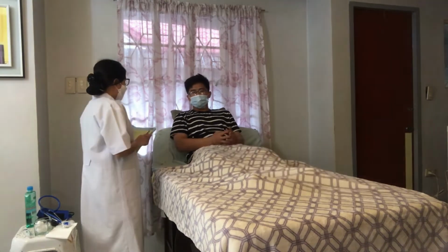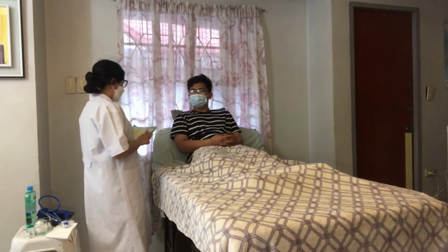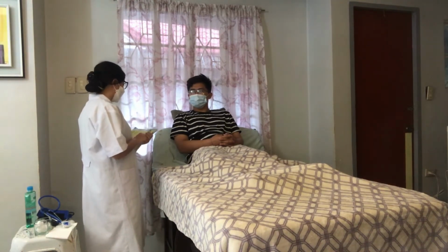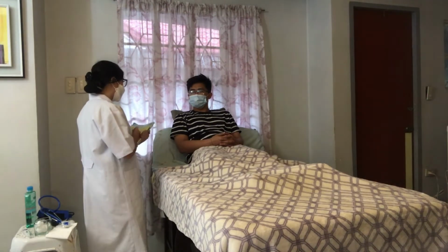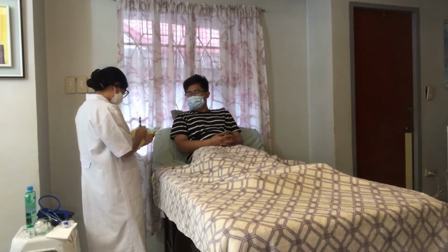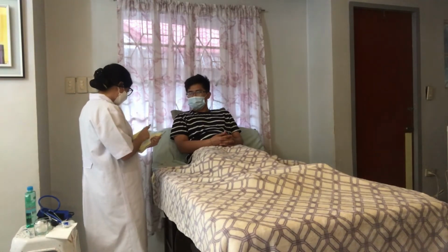Good day, sir. I am Erica Acido, and I will be your student nurse for today. So I will be taking your vital signs as per instruction by your doctor. So before that, sir, may I know what is your name? Right. How about your age, sir? 20. Alright, thank you, sir.